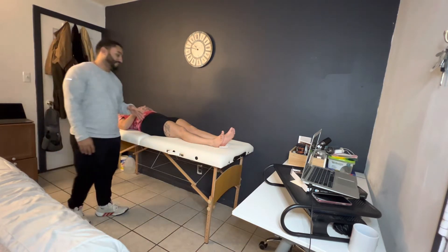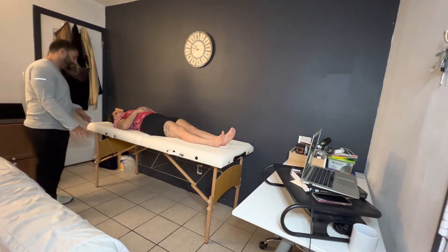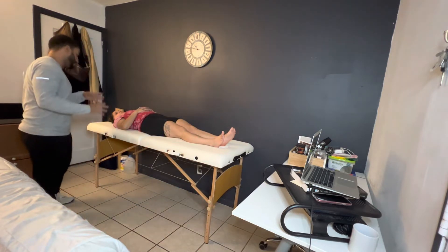Today we're going to go ahead and test your range of motion in your right knee — flexion and extension. We'll check out the left side just to make sure everything is good, but for the purpose of today we're going to go ahead and focus on the right leg.